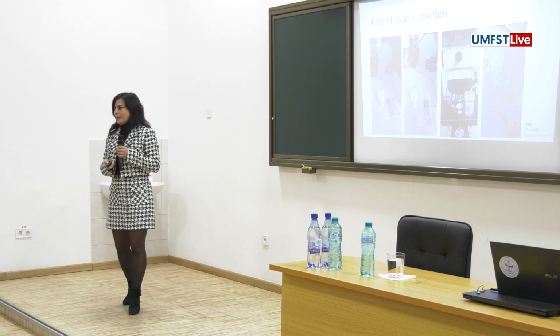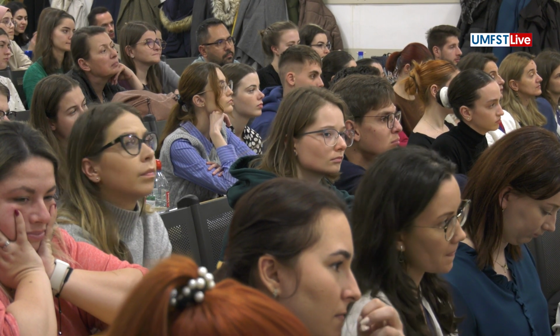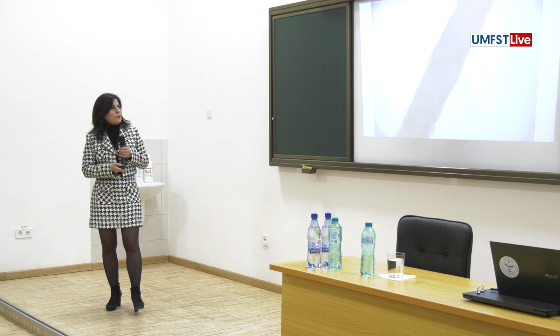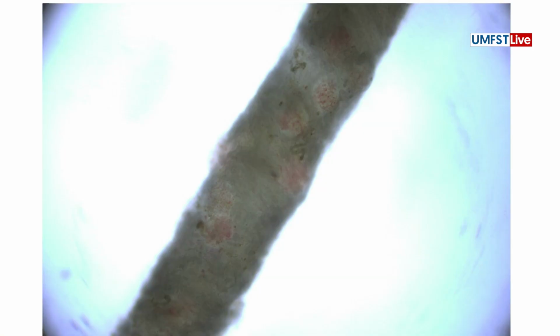Sometimes we don't have that opportunity, but if we have, we want a second or third biopsy for the patient. In microscopy, without staining, you see the glomerulus. We are counting that, the capillaries here. But sometimes it's not easy. I will talk about the pathologies.